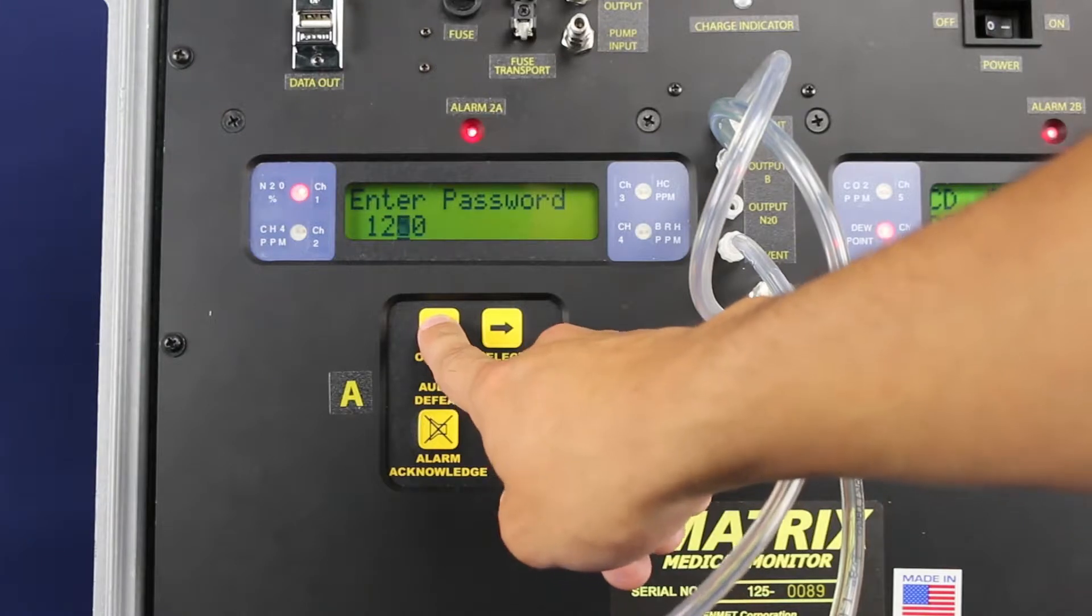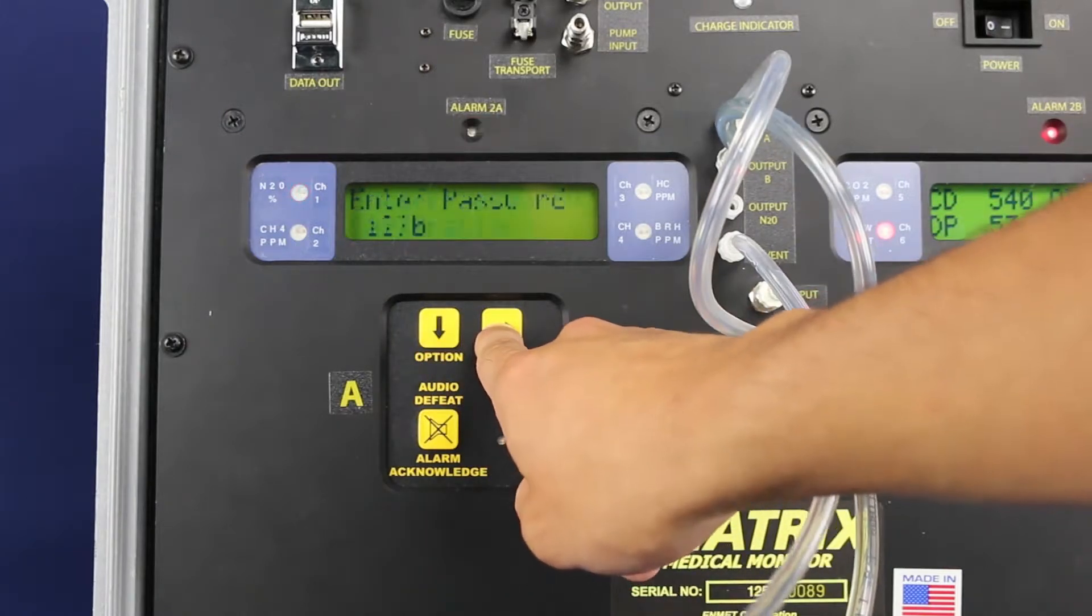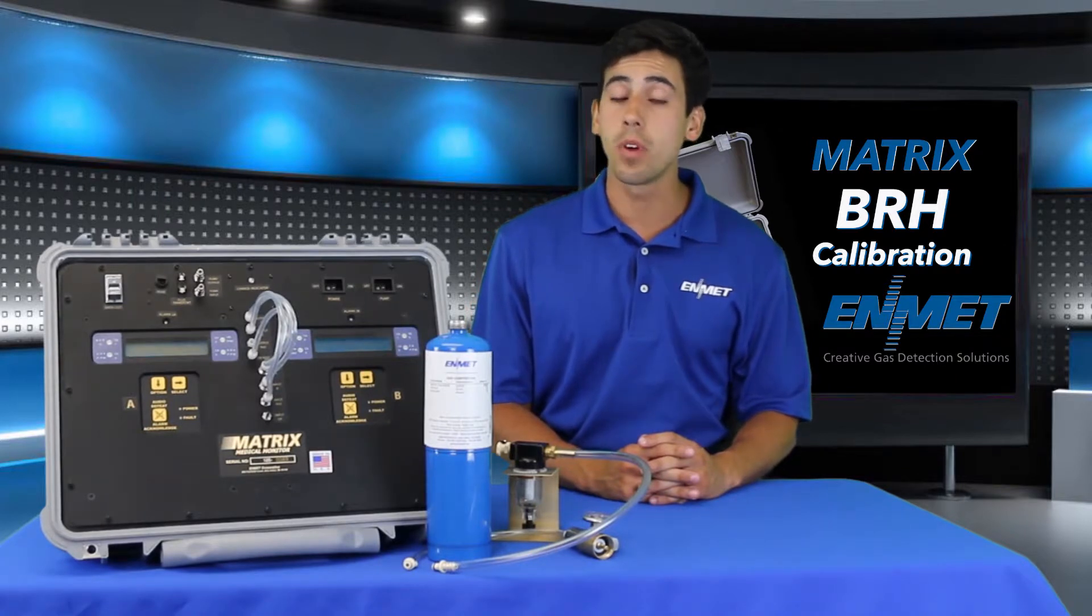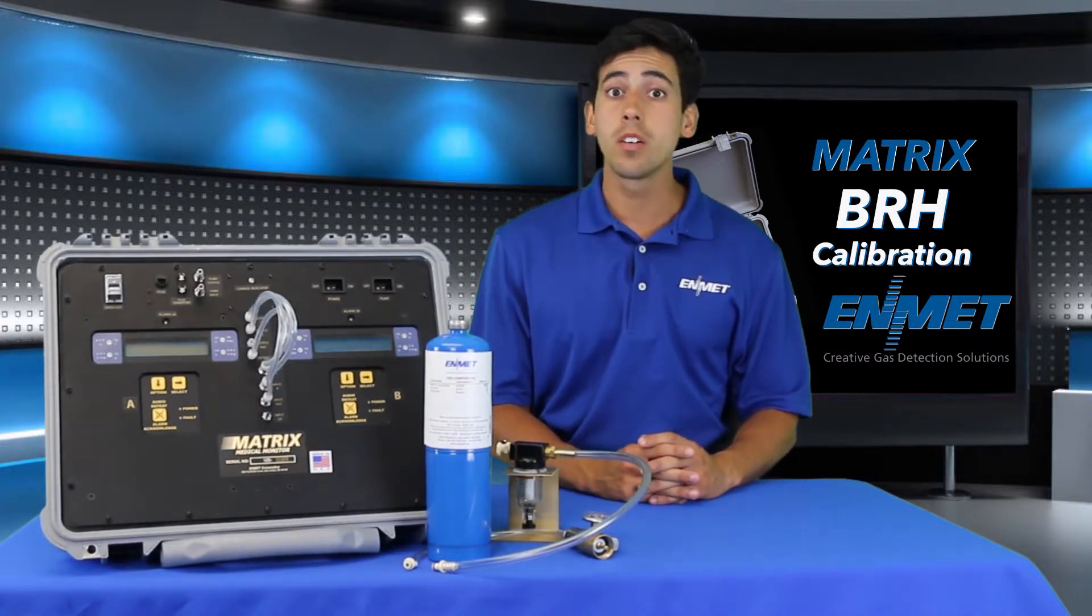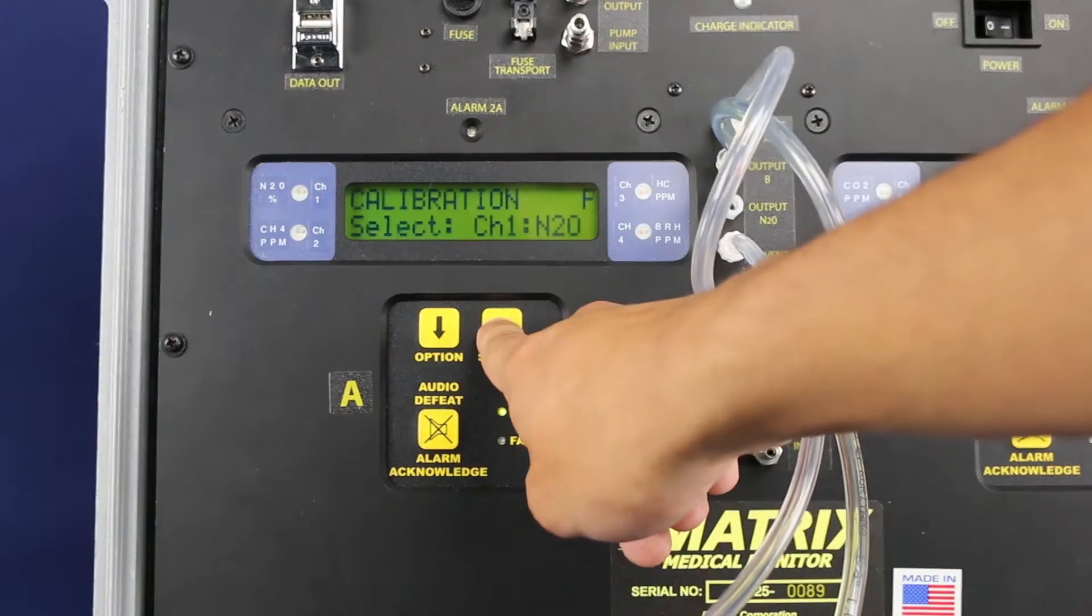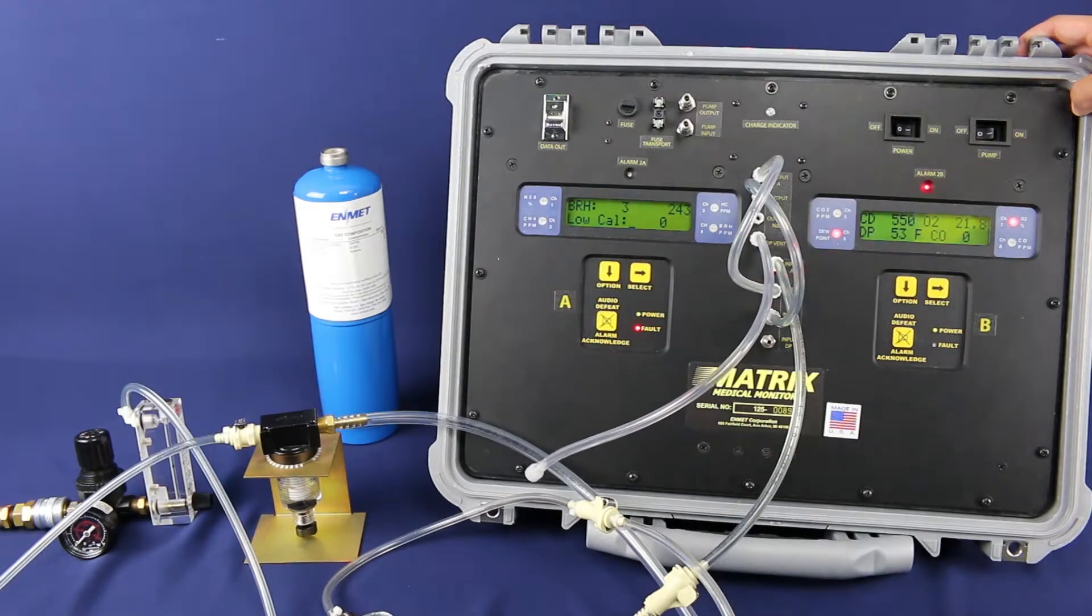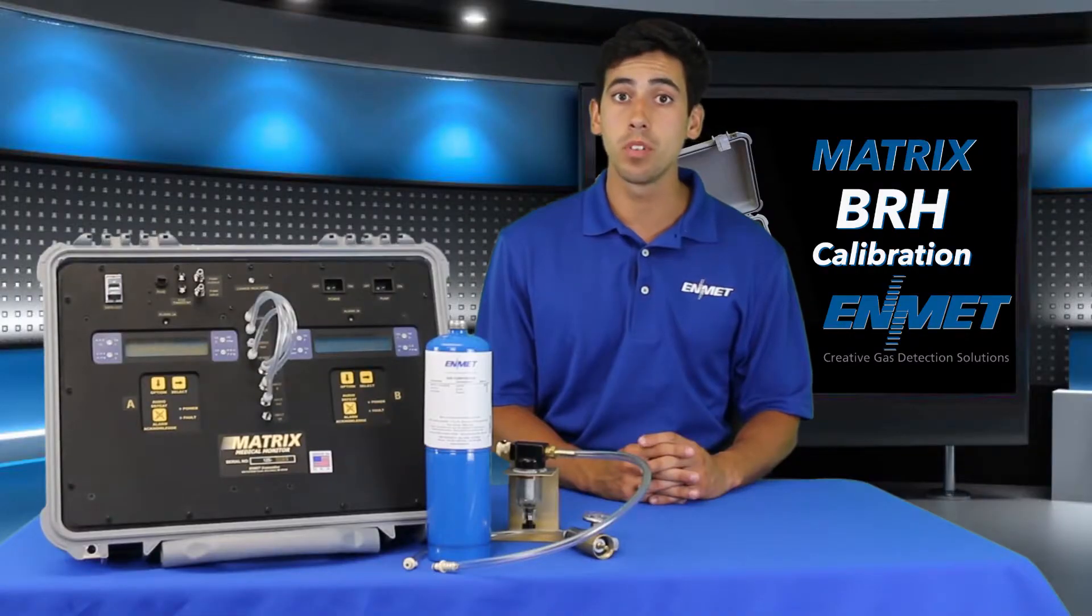Once you have entered the password, the calibration submenu option will be displayed. Press select to enter. Cycle through the channels using the option key until the BRH channel is displayed, then press the select button to enter the calibration procedure. At this point you are in the matrix calibration procedure for the BRH sensor.